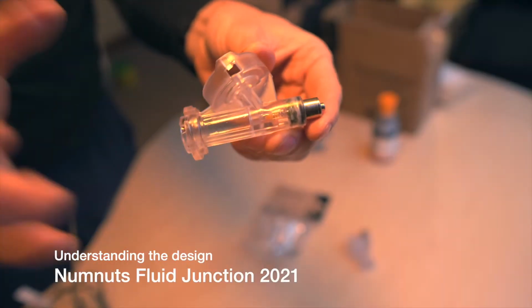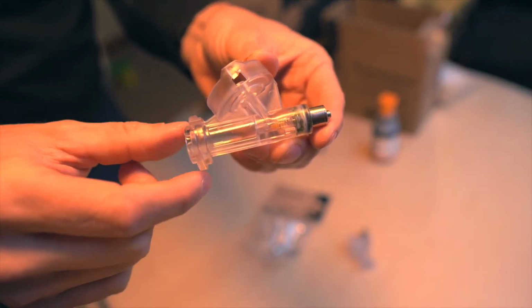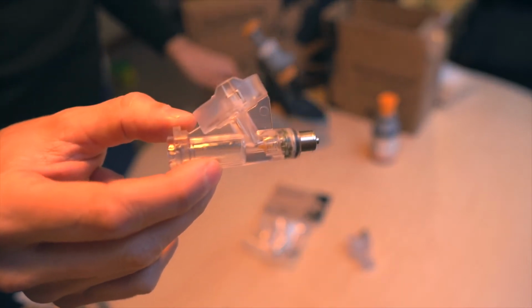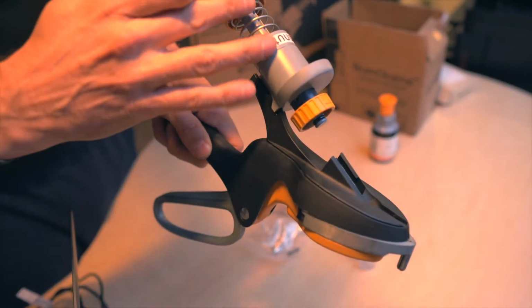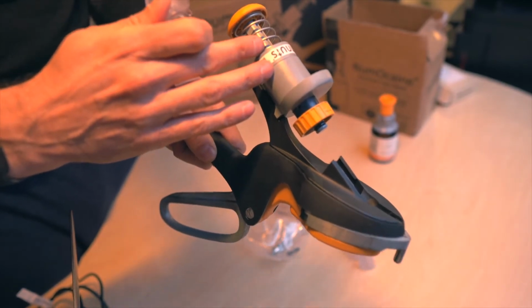This video is just a bit of a detailed insight into this one component of the Numnuts device, the fluid junction. So just a bit about the design philosophy. The Numnuts device has always been seen as a modular instrument, with the chassis being something that will last a long time. This part here at the top should last 20 to 30,000 injections.